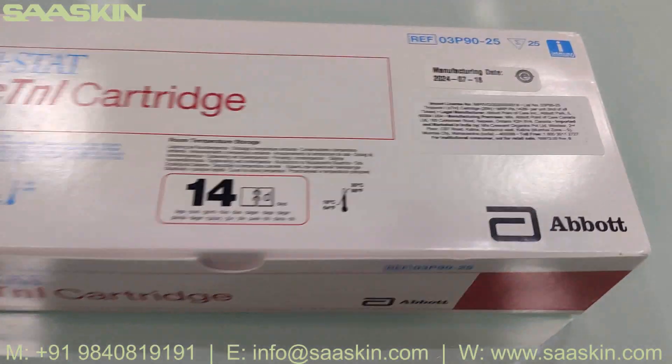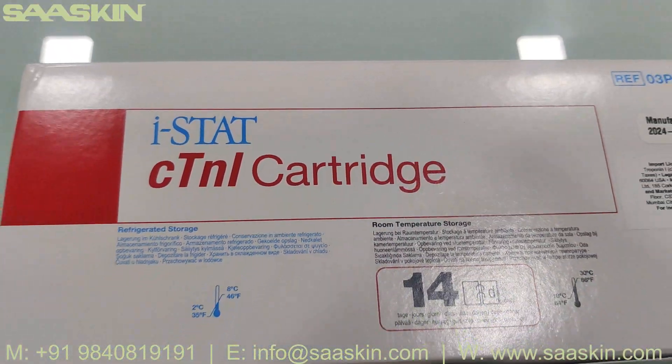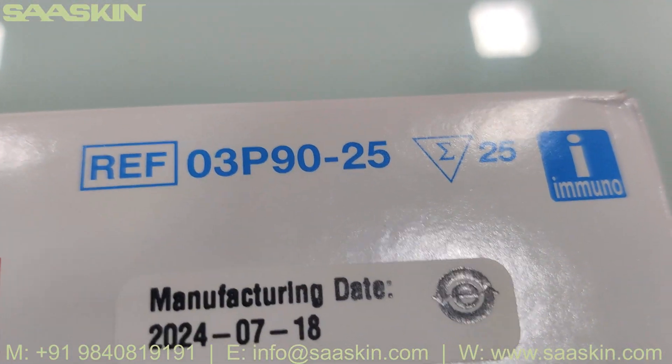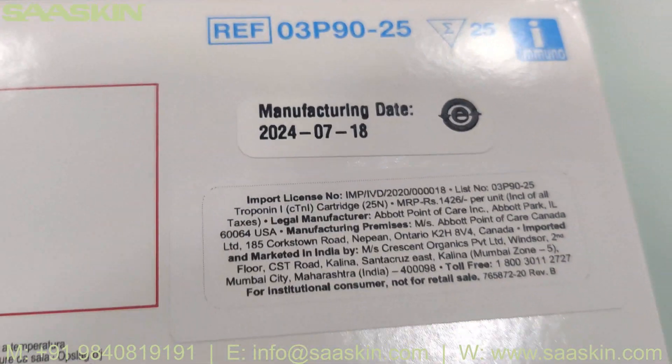Hello everybody, today we are going to see the unboxing of the iStat cTnI Cartridge. This is a 25 test kit pack — you can see the reference part number here: 03 P90-25. The manufacturing date is given on the box.